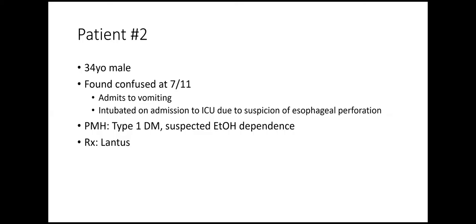Let me do a quick patient because this is a very interesting one. 34-year-old found confused and admitted with vomiting. There was a suspicion for Boerhaave's esophageal rupture, but that was not the case. Patient was found to be diabetic, has history of substance abuse, and this is the EKG.